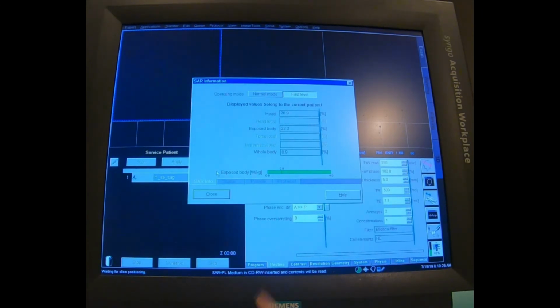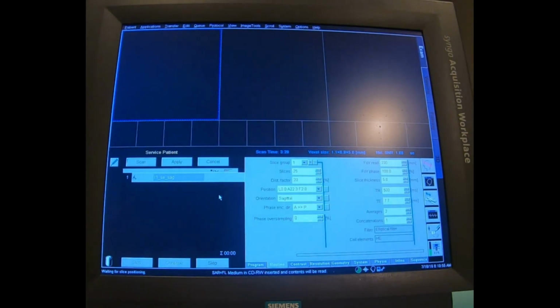But one thing to remember is if you're at first level and you're getting SAR problems on a lot of different patients and a lot of different protocols using different coils, etc., you may have a problem with what's called the TALES, or the transmit antenna level sensor. And what the transmit antenna level sensor is doing is it's monitoring the amount of RF coming out of the RFPA through itself for runtime SAR. So as RF is getting transmitted through the RFPA, through the cables, through the TALES into the patient, it's going to monitor the amount coming out of the RFPA, monitoring how much is into itself, comparing the two, make sure that they match, and then transmitting into the patient.